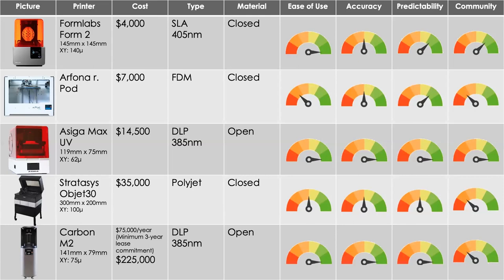The reason for this is because you think, okay, well, lasers are a point, but remember, we are sourcing much cheaper light engines for something, let's say, like the Formlabs. And so if you point something perpendicular to a wall at a 90 degree angle, it's a perfect circle, right? But if you're pointing at like a 45 degree angle or some very steep angles, that circle then starts to become elliptical. And it also loses fidelity over long distances. So something like the Formlabs, it's a fantastic hobbyist printer. It revolutionized the SLA segment, and that's why it's so popular. But for dental, you do really need something that is much, much more accurate.